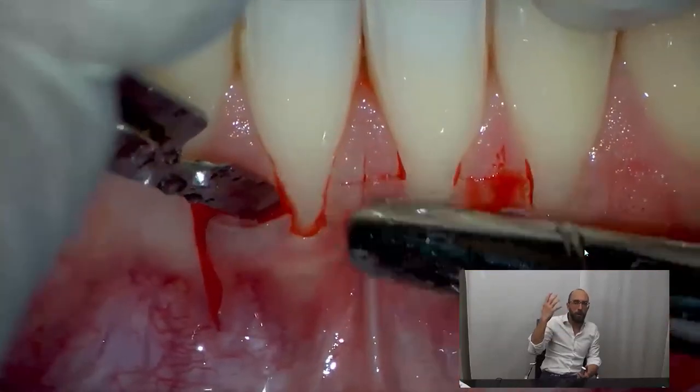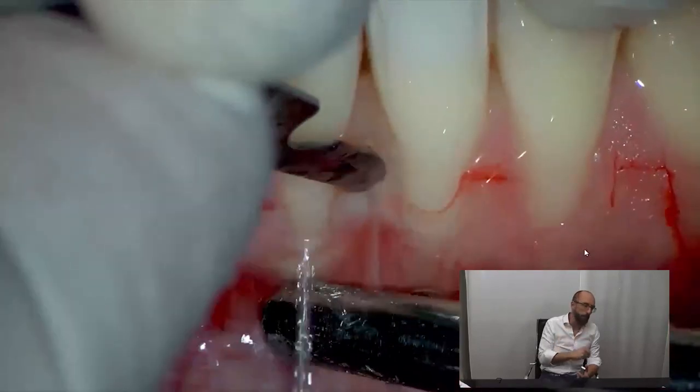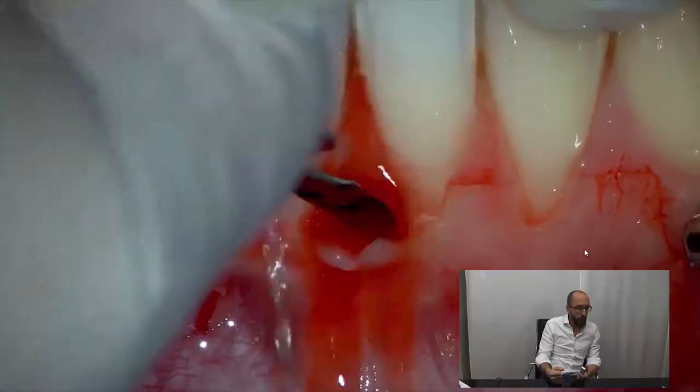Start from the maxilla first, then the posterior mandible, and only when you are very experienced go to the anterior mandible. You can see that the tissues are very weak here — you have to be very, very careful.